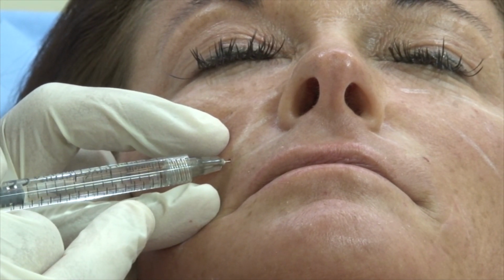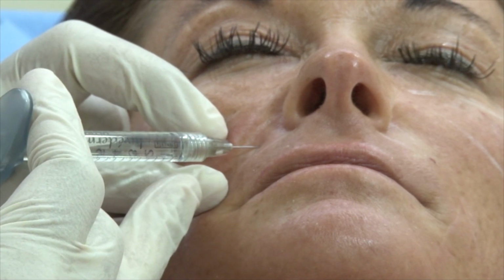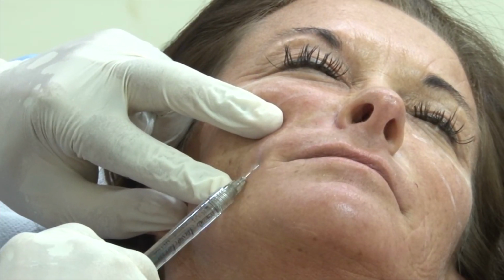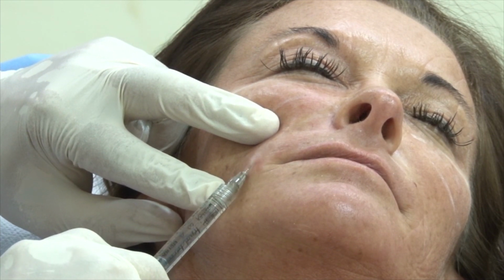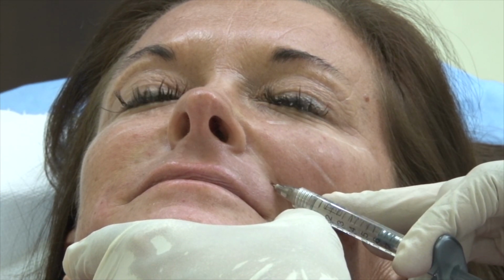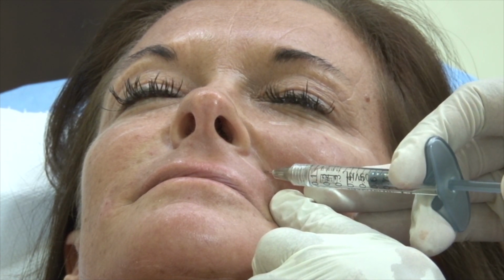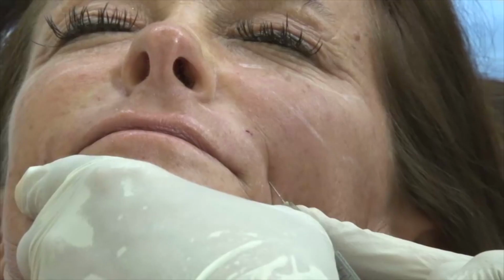Now I am placing the filler deep just above the periosteum in the upper part of the nasolabial area, which is deep, and my direction of the needle is more medially. In the lower part of the nasolabial fold, I am injecting very superficial, just subdermally. Now the key to prevent intravascular damage or injection is to be gentle, slow, and inject very small quantity. So in the upper part of the nasolabial fold, it is pre-periosteal. In the lower part, it is subcutaneous.